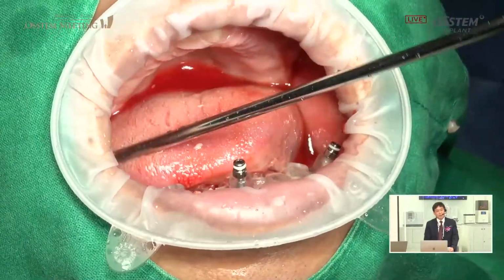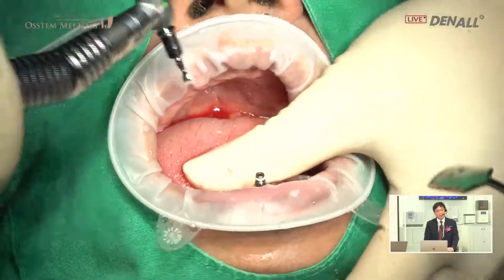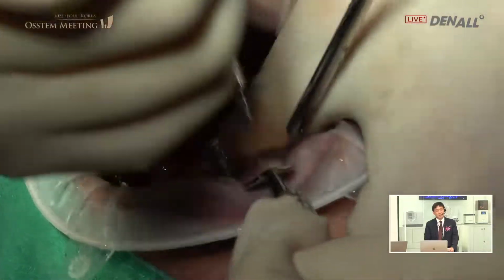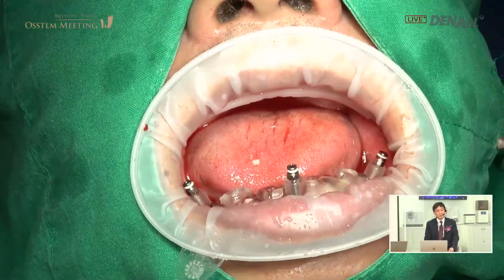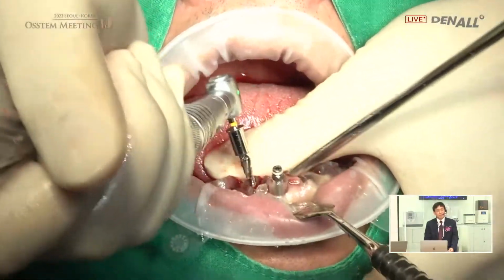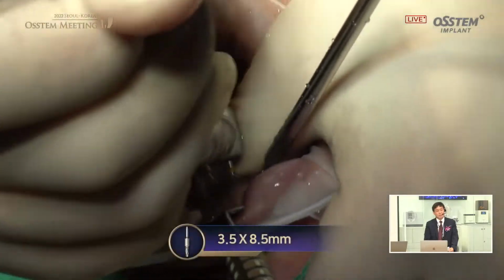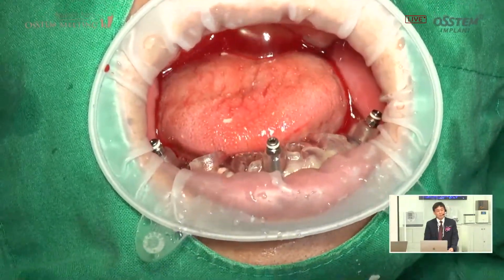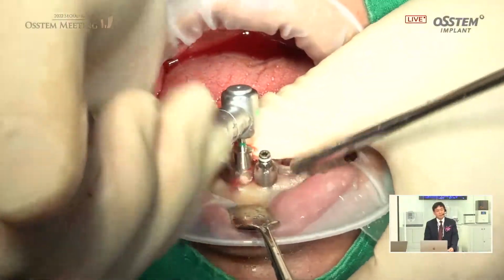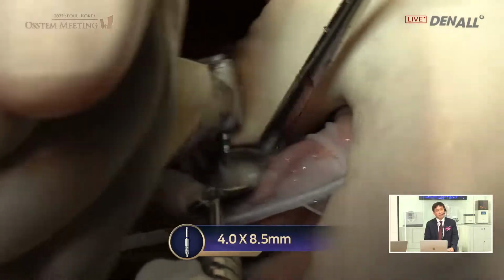A 3.5mm initial drill for soft bone is used. Initial drilling is done in 4 areas. In the lower anterior, numbers 32 and 42. In the designed area, path drilling is done and prep work is being done. The drill that I'm using is the 3.5 by 8.5 OneGuide drill. And next, he's using 4.0 by 8.5.